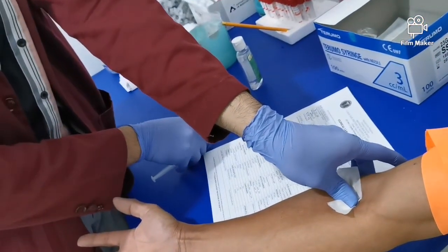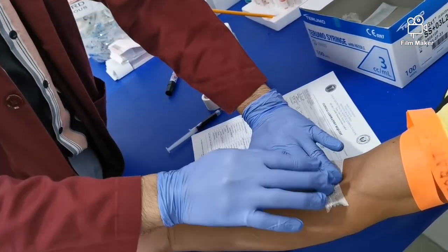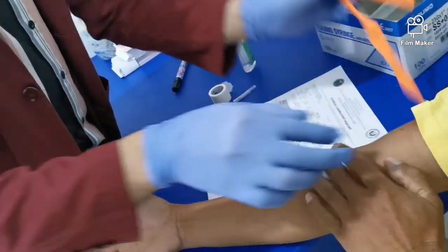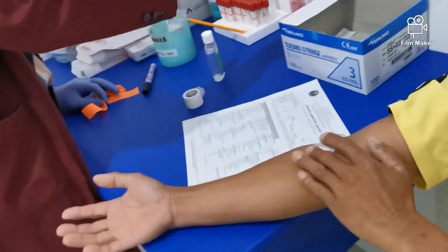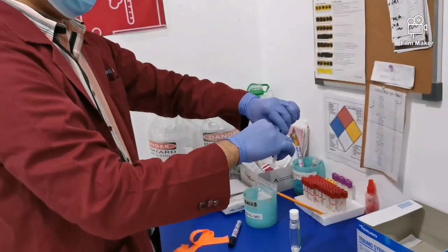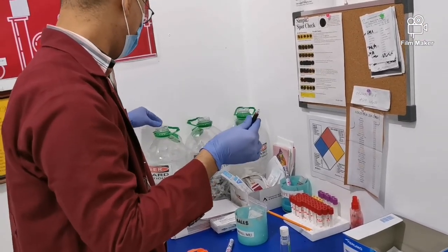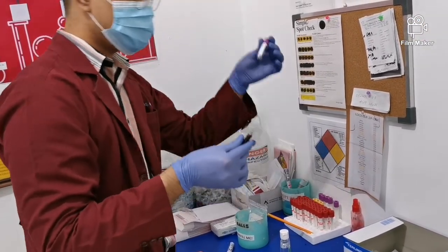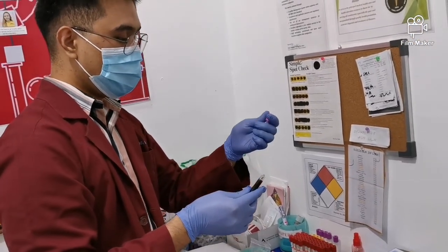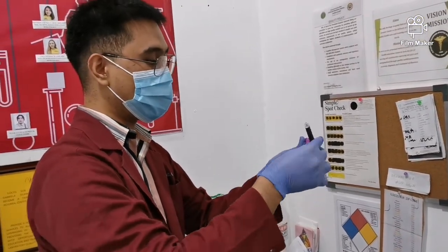Okay. Sir, papindot na lang. Pindot mo, sir. And then, next thing na gagawin mo, steady, transfer mo yung blood into its proper collection tube. So, for CBC, EDTA, purple top. So, may line dito, okay? So, hanggang doon lang dapat yung ilalagay natin.